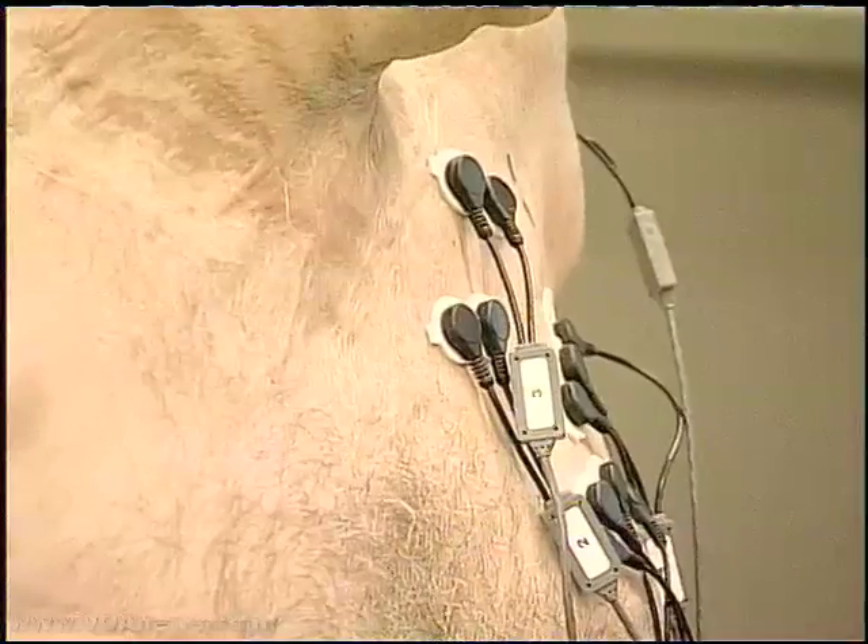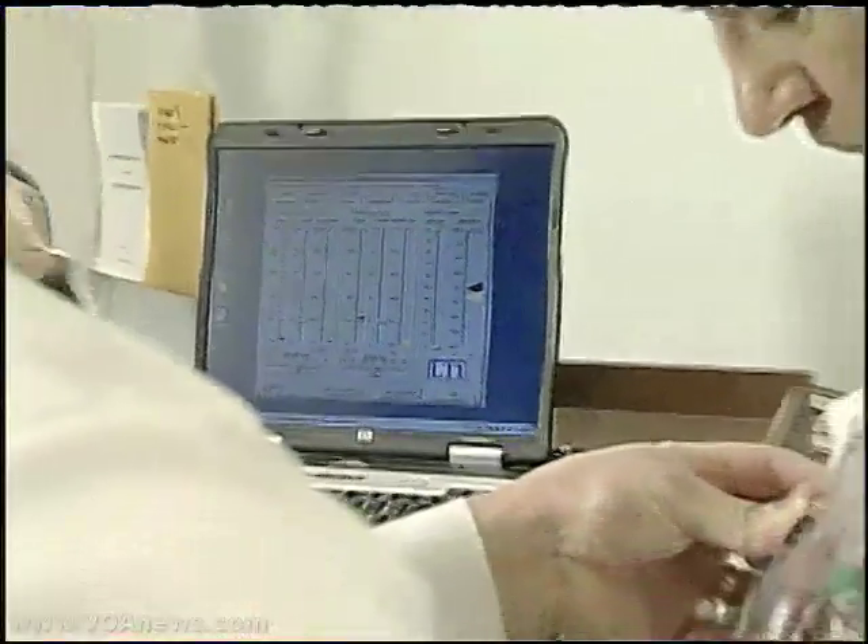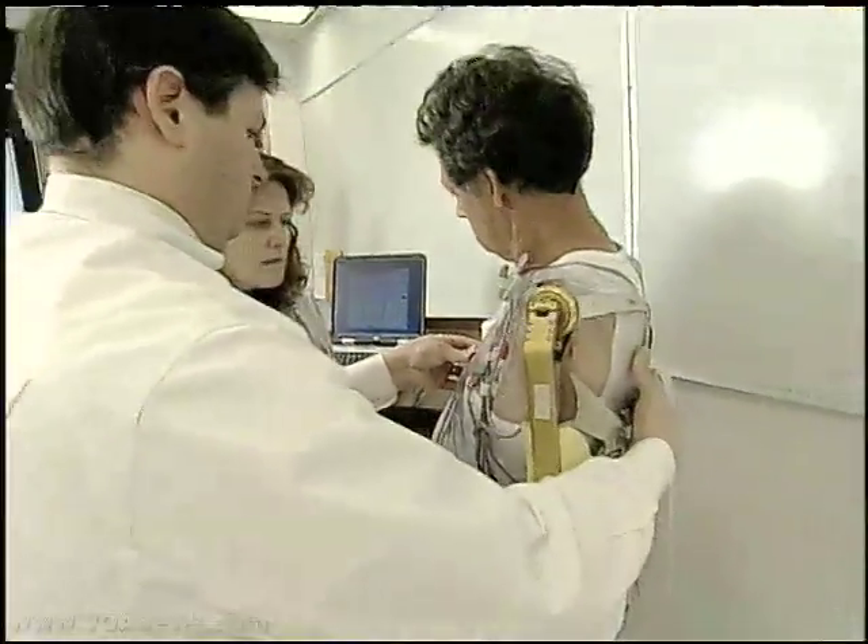We've developed a technique to take the arm nerves and move them to different muscles in the residual limb or chest. Electrodes placed over the muscles act as antennas that receive signals from the brain, that direct movement of the prosthetic arm.